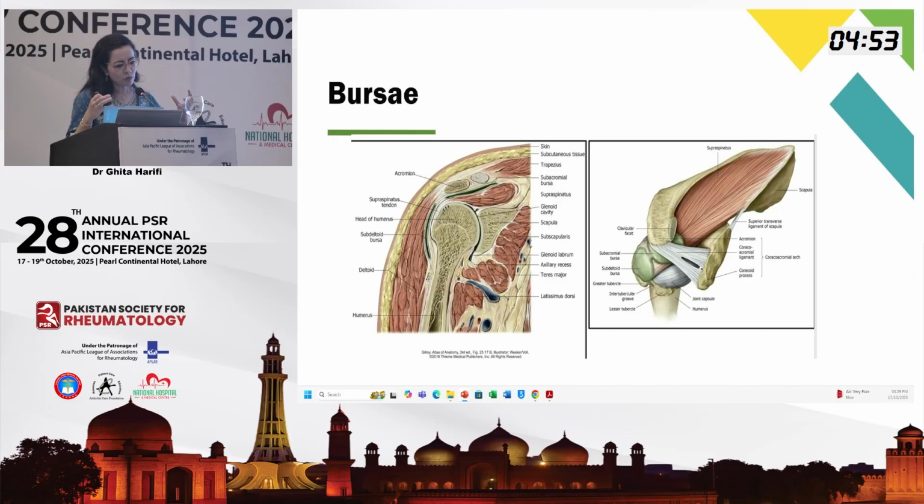In fact, these are two bursas, one that comes just below the deltoid and one below the acromion, but they are communicating, and therefore we consider that it's the same bursa. In other words, when you're scanning and you start seeing the bursa, you will have to follow it. If you're coming from the acromion, you have to go to the deltoid, and if you're starting from the deltoid laterally, then you'll have to follow this bursa also, in the proximal part.